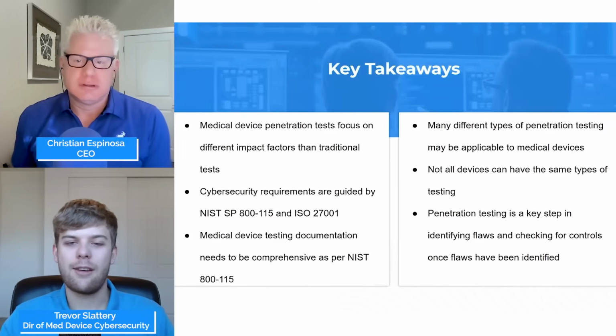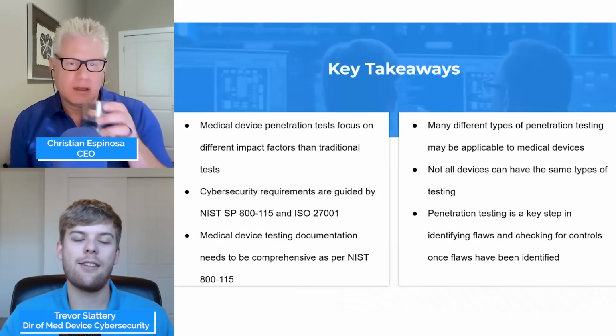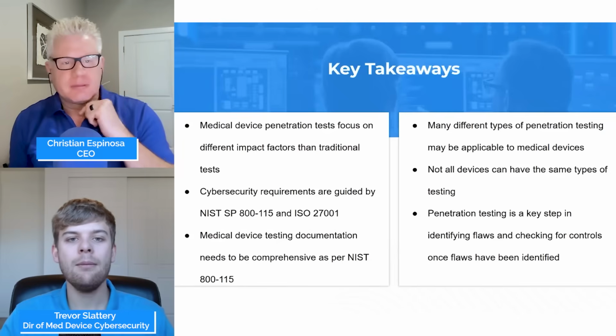All right, I want to look at some of the key takeaways, and then we'll turn over and see if there are any questions available. So, medical device penetration tests focus on different impact factors than traditional tests. Again, we're looking at that patient harm and patient health information loss as the primary focus. Traditional tests are more concerned about confidentiality, integrity, and availability.